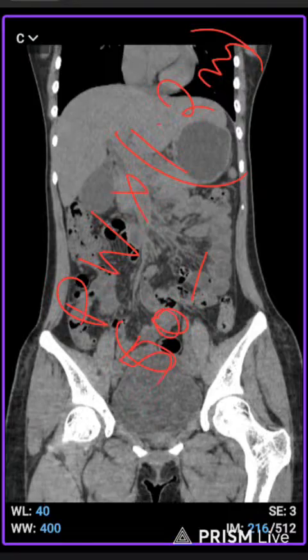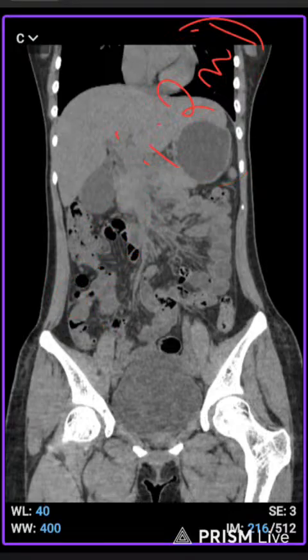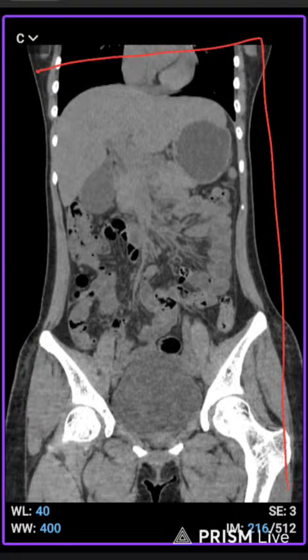Patient weight into 1.2 ml is the universal ratio to give the contrast according to the patient weight. After that, you have to prepare a plain scan of the whole pelvic area.